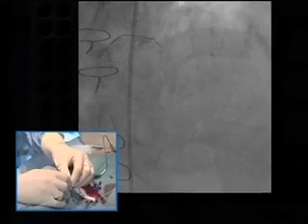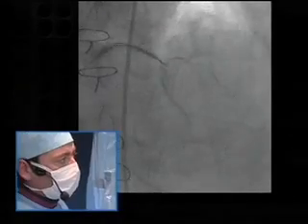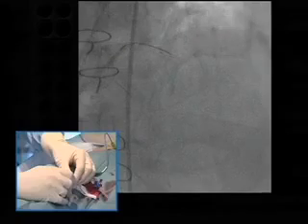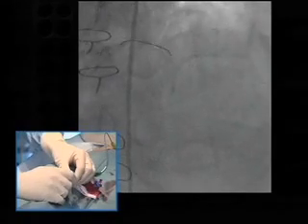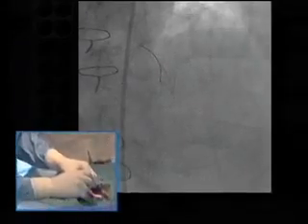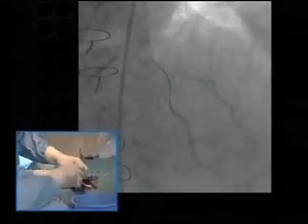I think the issues here are just what we were talking about. One, the calcification. Are you going to be able to adequately expand both the main lesion and the side branch? And I think either SKS or culotte is appropriate. But I agree with you, Raj, that it's a bulky lesion on both sides. It may be that once you can expand both, hopefully appropriately, culotte is not a bad way. I agree. I don't think provisional stenting is the way to go for this caliber side branch and disease pattern.